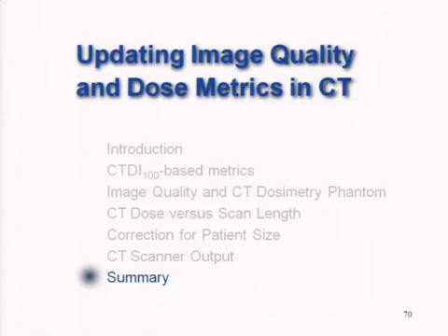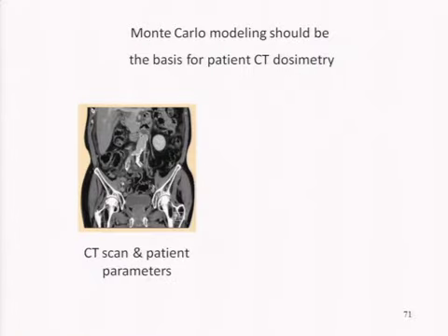So, in summary, we strongly believe, we being the members of the committees that I have mentioned, and certainly the ICRU committee that I chair, that CT scan and patient parameters really are useful not for calculating dose per se. CTDI vol is not a dose value.